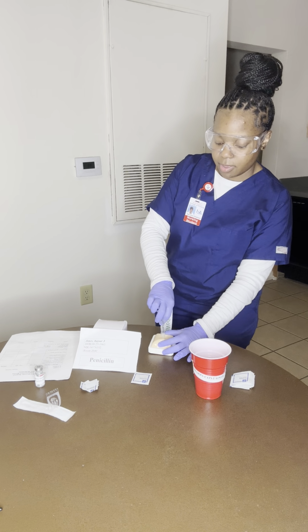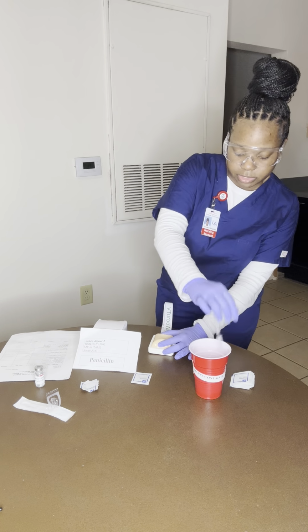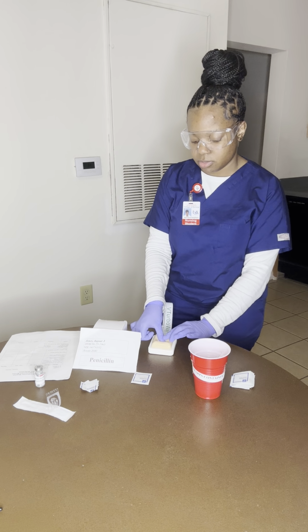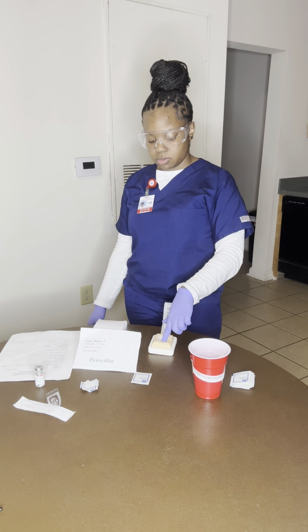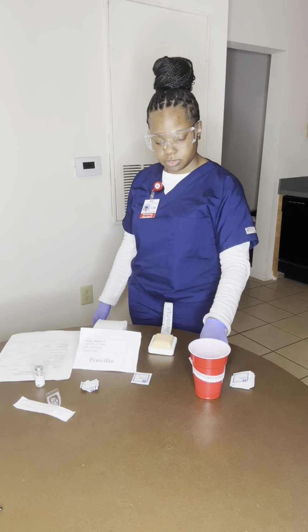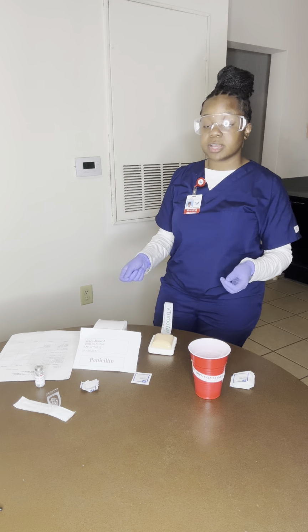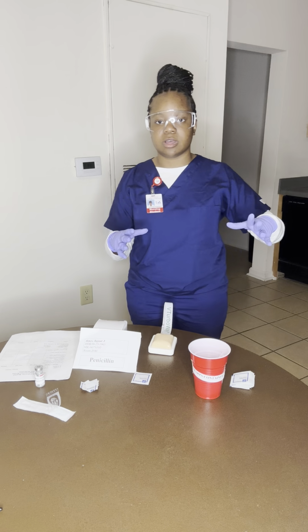I'm going to pull it out, hold the pinch for 30 seconds, and put this in my sharps container. I'm going to apply pressure, and place this in the container as well. So now I am going to lower the side rails. Raise the side rails. I'm going to lower the bed to its lowest position. I'm going to make sure my patient is comfortable.